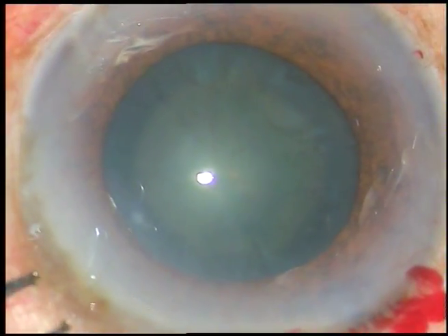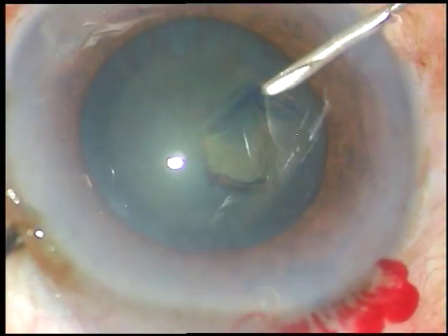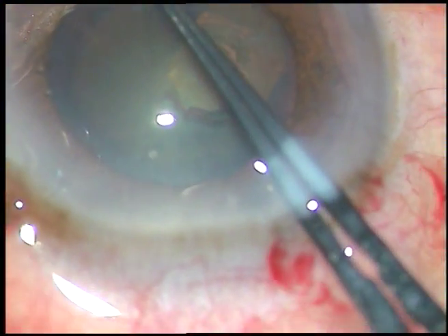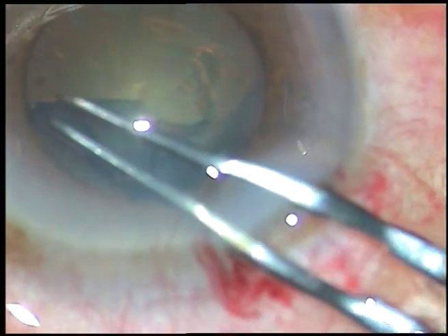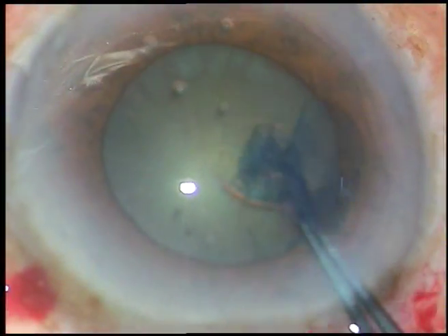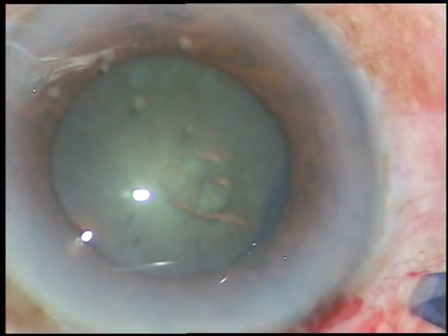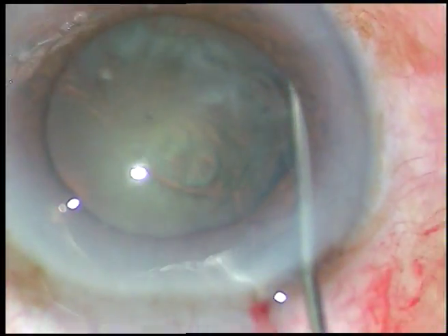Now I am going to do capsulorhexis. I am going to incise the capsule with a bent cystitome 26-gauge needle. Now I am using Utrata forceps, holding this capsular tag and going all around just along the border of the pupil. In some places it has gone beyond the margin of the pupil. This area will be used as a reference to confirm whether the lens is in the capsular bag or not.